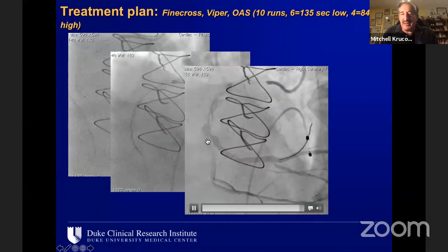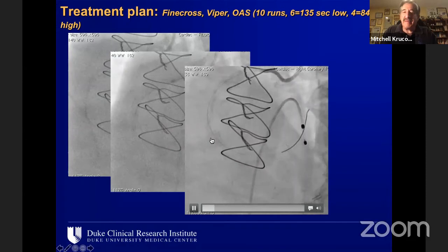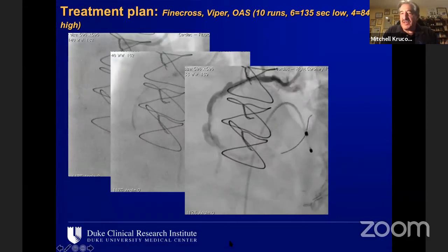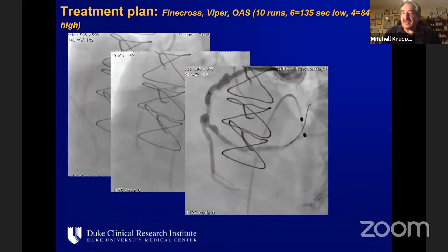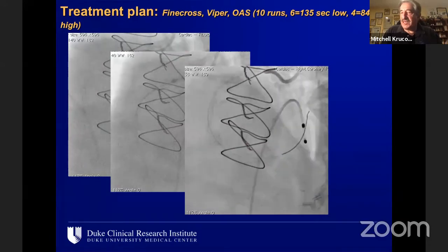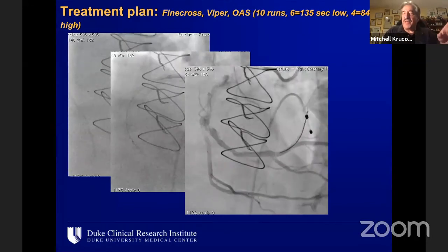Straightening, now you can see how straight this mid-right actually is meant to be. And with sufficient ablation, my road test is to just see, can we dilate it to full size and or place a stent. So I'm not a big advocate of repeated intravascular imaging.